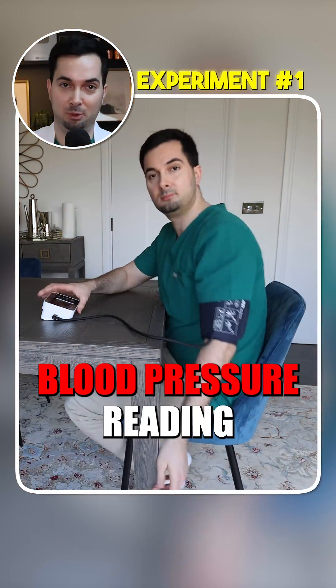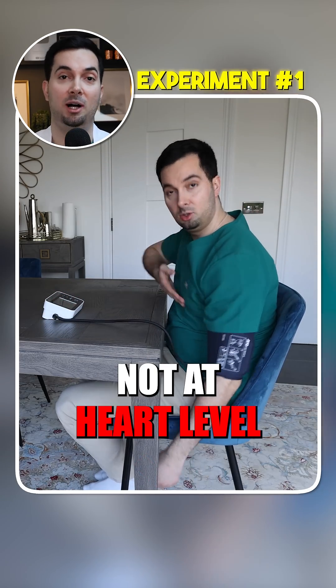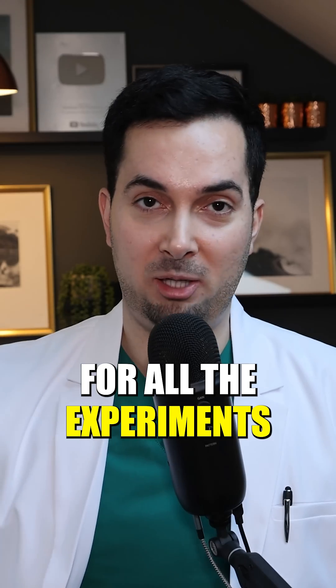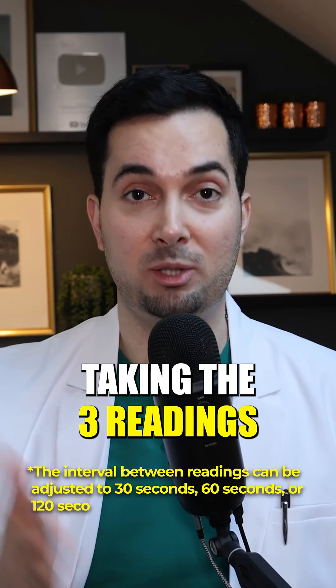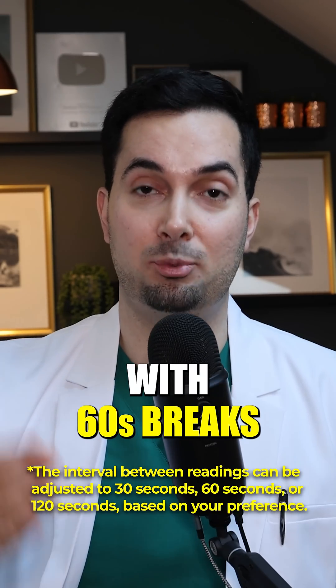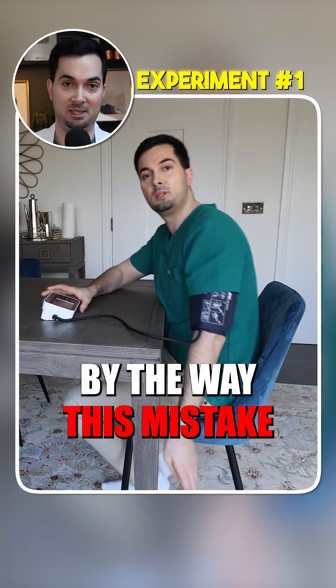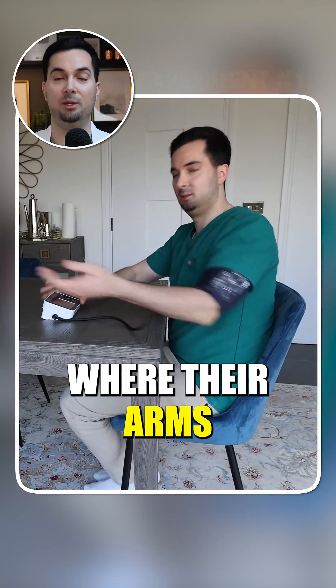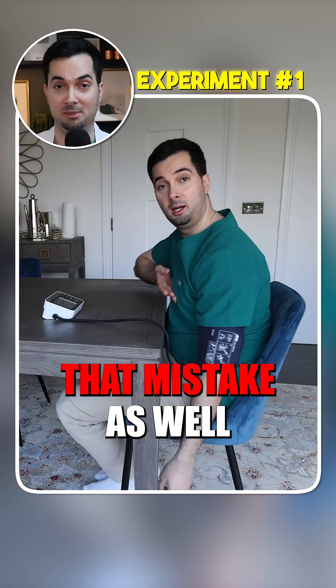Experiment number one: we're going to take the blood pressure reading with my arm not supported and the cuff not at heart level. For all the experiments I'm going to be using our TryCheck technology, taking three readings with 60-second breaks in between each one and averaging them. This is quite a common mistake that I see a lot of patients make — their arms aren't fully supported or the cuff isn't at heart level, so really think about whether you're making that mistake as well.